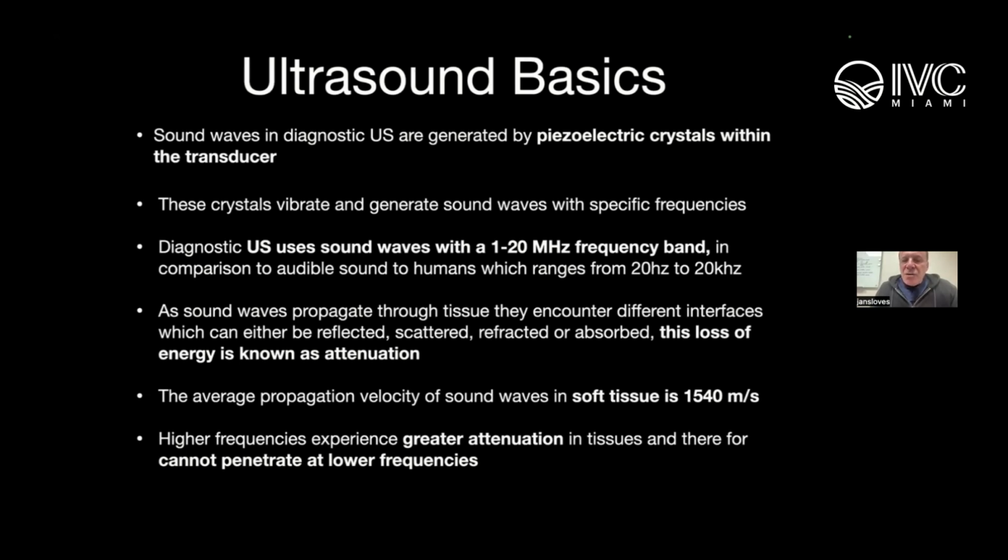So diagnostic ultrasound uses waves with a 1 to 20 megahertz frequency band. Interestingly, in comparison to audible sound in humans, which ranges from 20 hertz to 20,000 hertz.